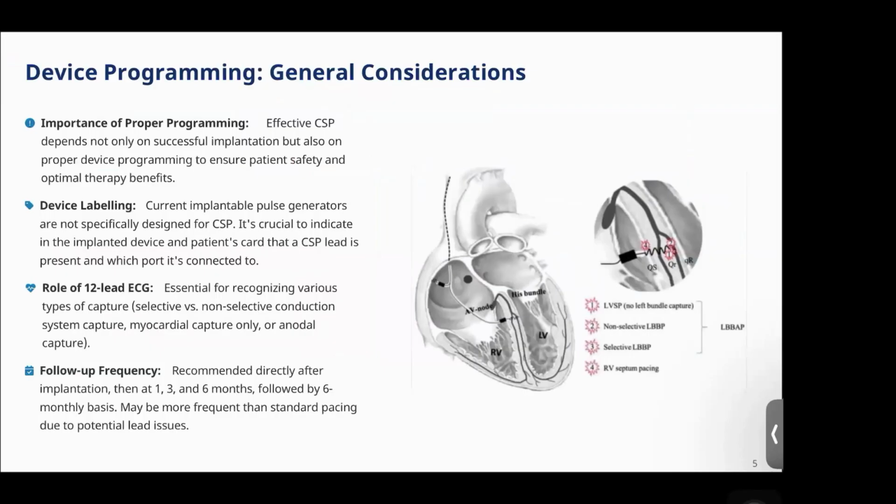Device programming: what are the general considerations? Importance of proper programming. Effective conductive system pacing depends not only on successful implantation, but also on proper device programming to ensure patient safety and optimal therapy benefit.